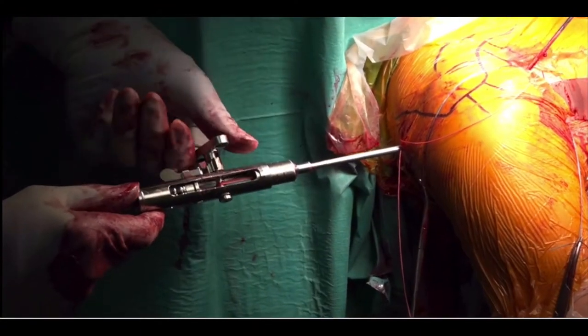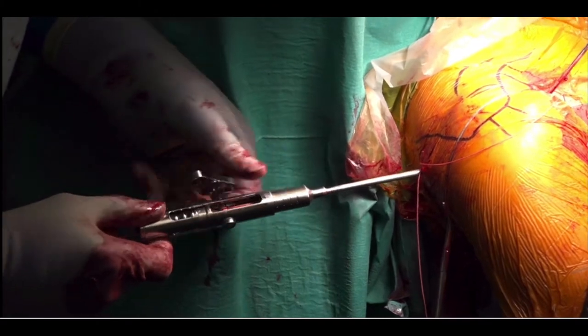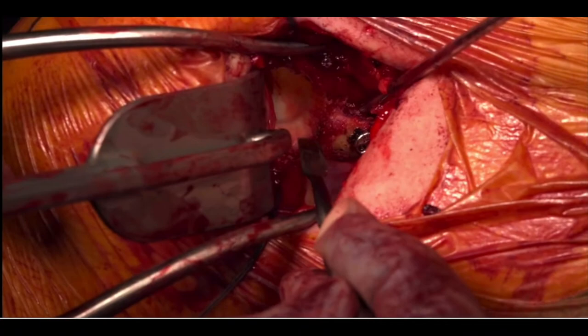Posteriorly, a button is loaded onto the inferior sutures and an east knot tied. This is then pulled tight and tensioned to 100 newtons, tied off and repeated for the superior button. This fixes the coracoid securely in the inferior quadrant with no lateral overhang.